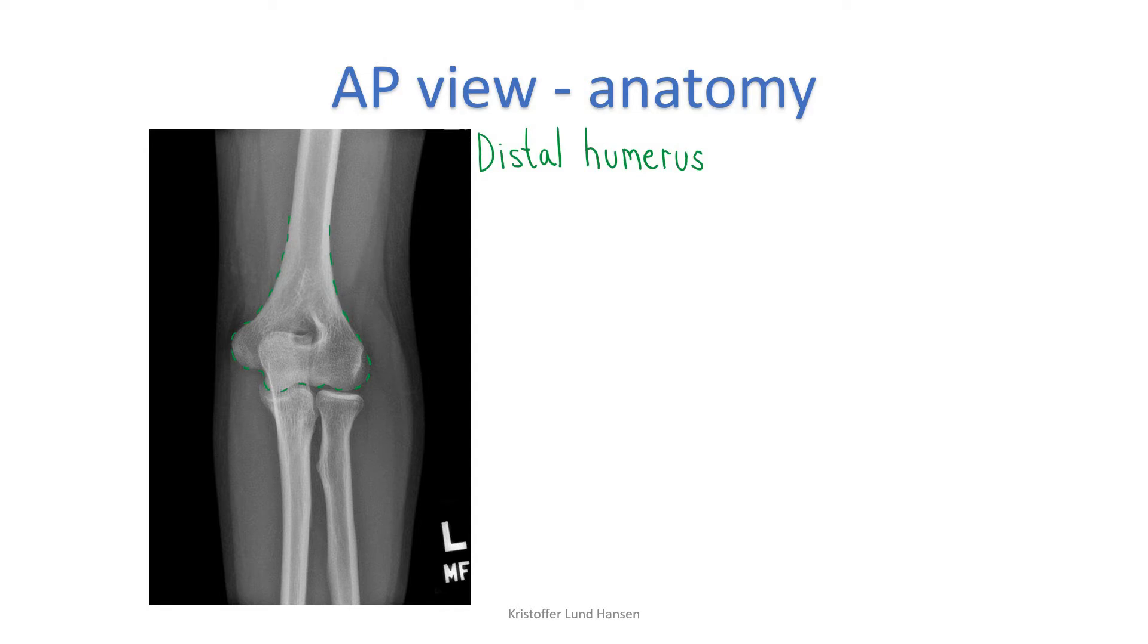First, we have the distal part of the humerus, marked green. The distal part of the humerus has more interesting structures that we have to know of. The most distal surface that is articulating with the ulna is the trochlea. The surface that goes against the radius is the capitellum. On each side of the distal humerus, we have both the lateral and the medial epicondyle.